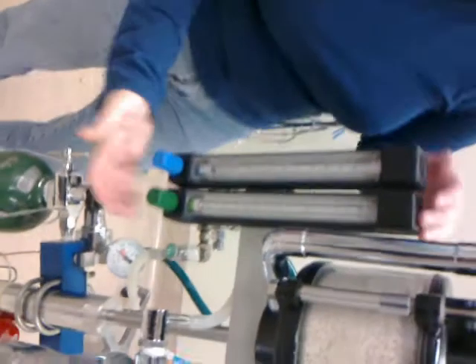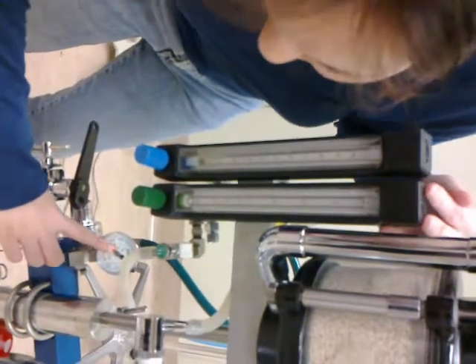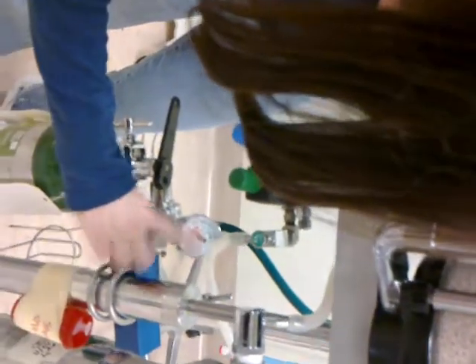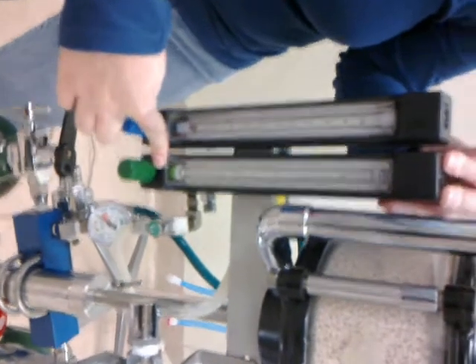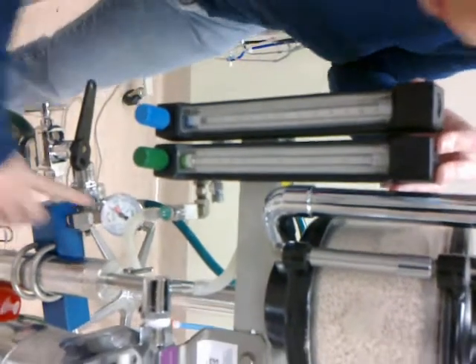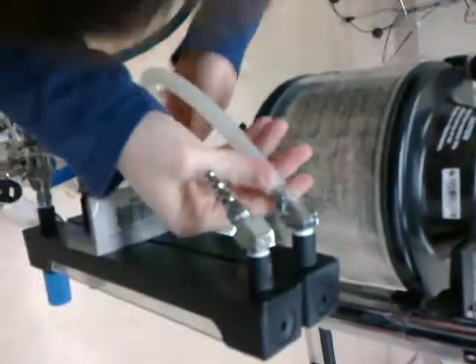The flow meter is where you can adjust the PSI, which goes from whatever the tank pressure is, down to 45 and then down to 15. At the very top and on the back of it is a tube connecting the oxygen flow meter.